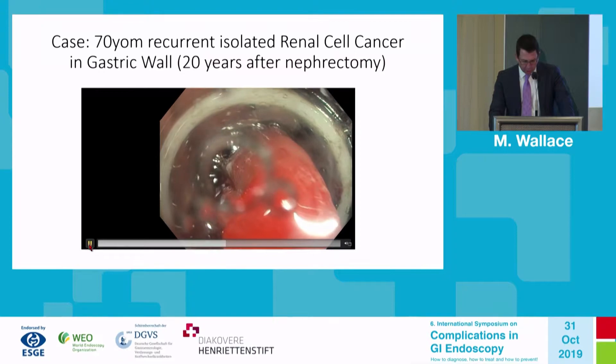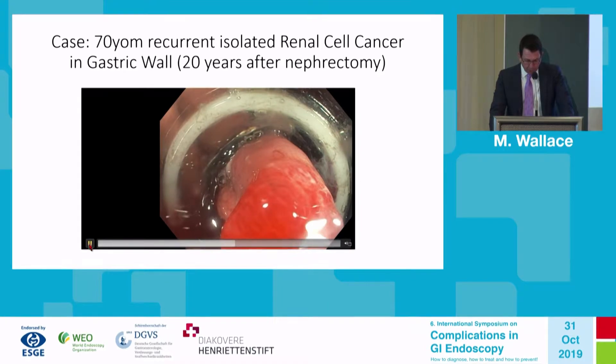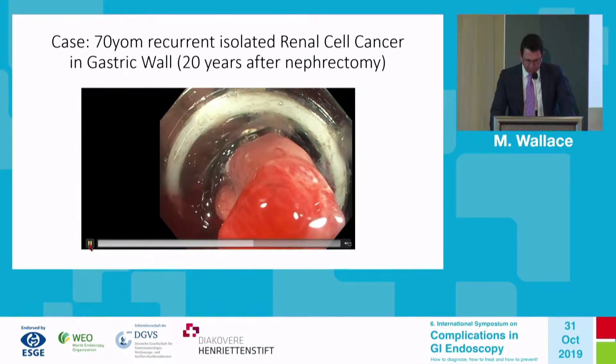At approximately 10 o'clock you can see one of the cautery marks. Now watch the white ring move forward as we deploy the over-the-scope clip. It's very important for safety reasons and prevention of complications that we fully deploy the over-the-scope clip before closing the snare.